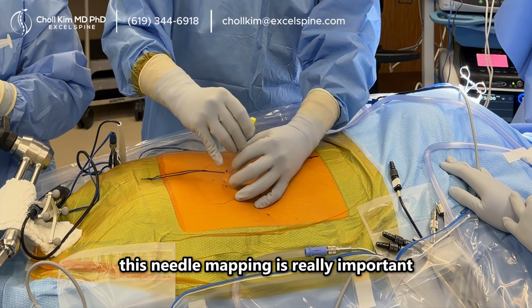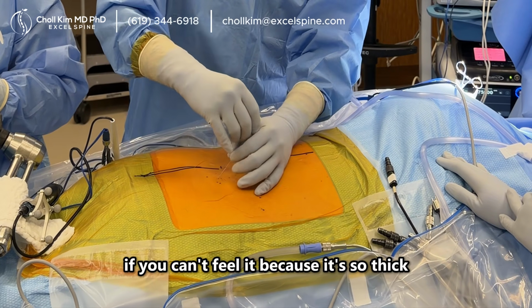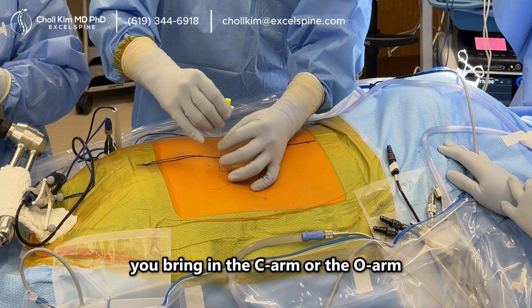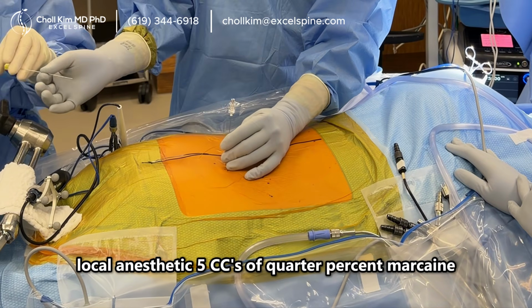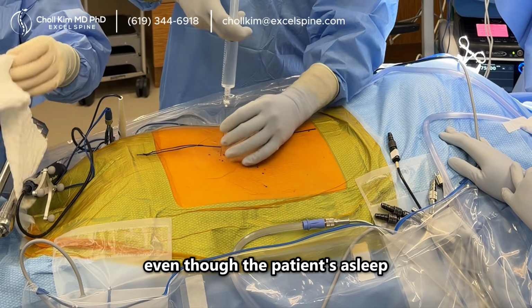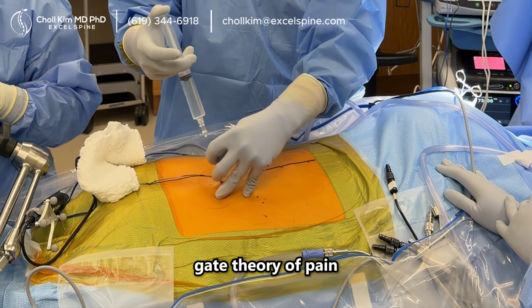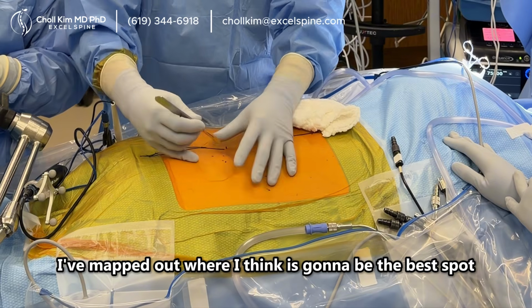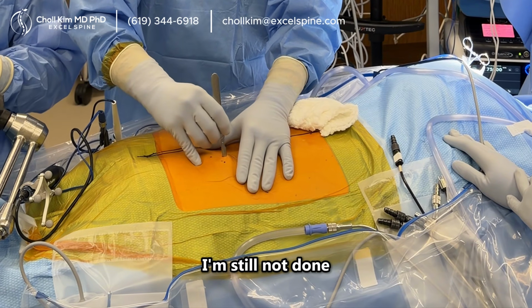This needle mapping is really important because it's just not enough. And then finally, if you can't feel it because it's so thick, you bring in the C-arm or the O-arm and do it under fluoro, but this feels perfect. Local anesthetic, 5 cc's of 1/4% Marcaine. Even though the patient's asleep, because I believe in the gate theory of pain. Okay, I've mapped out where I think is going to be the best spot, a little stab incision. I'm still not done.